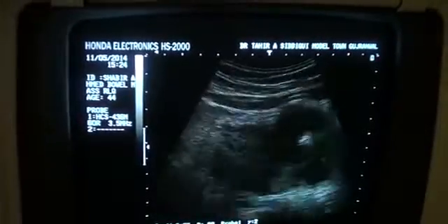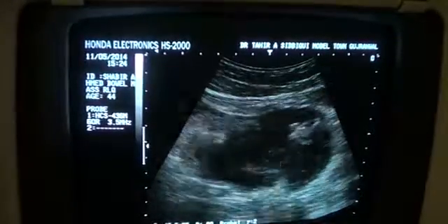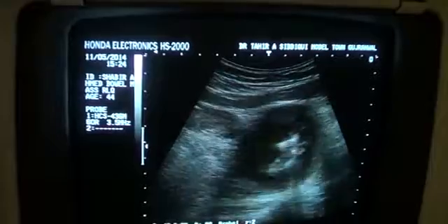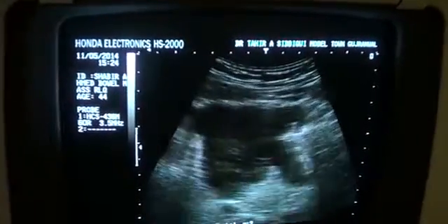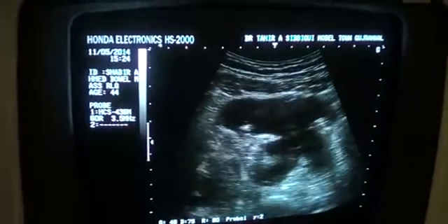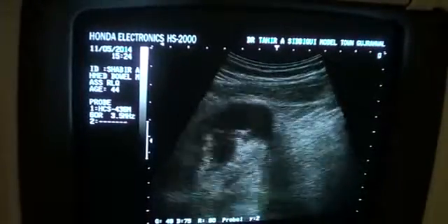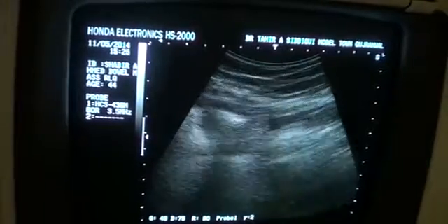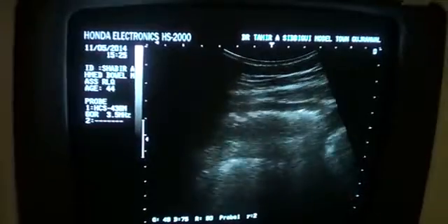So what we will do now is I would like to see if there is any splenomegaly or para-aortic lymph nodes. I would like to see any pleural effusion. Now this mass is okay. This is an ileocecal mass of infective or benign nature, and there is no other associated pathology seen.